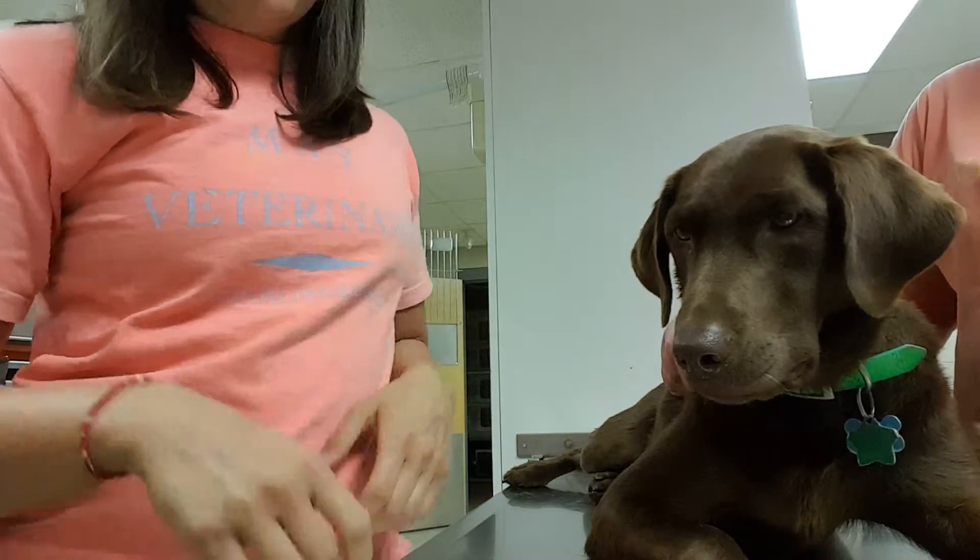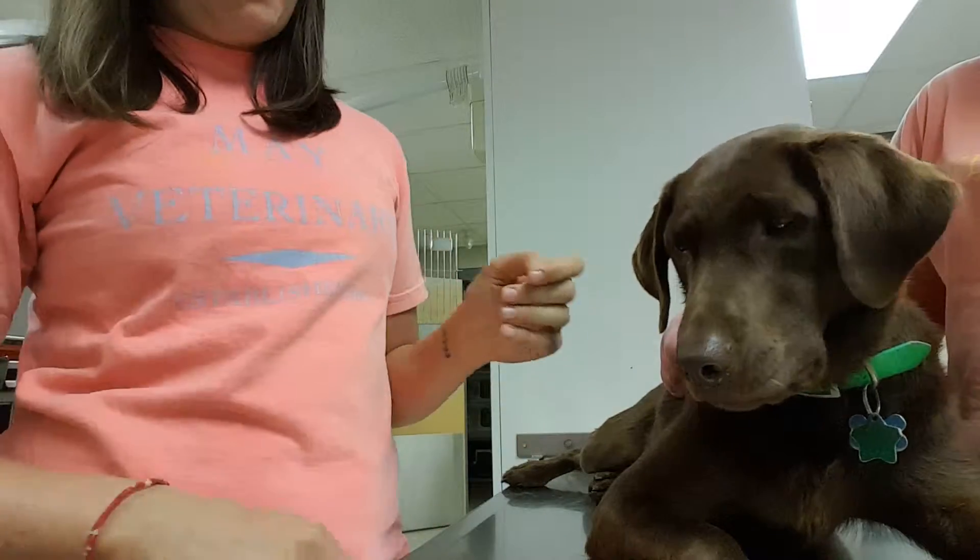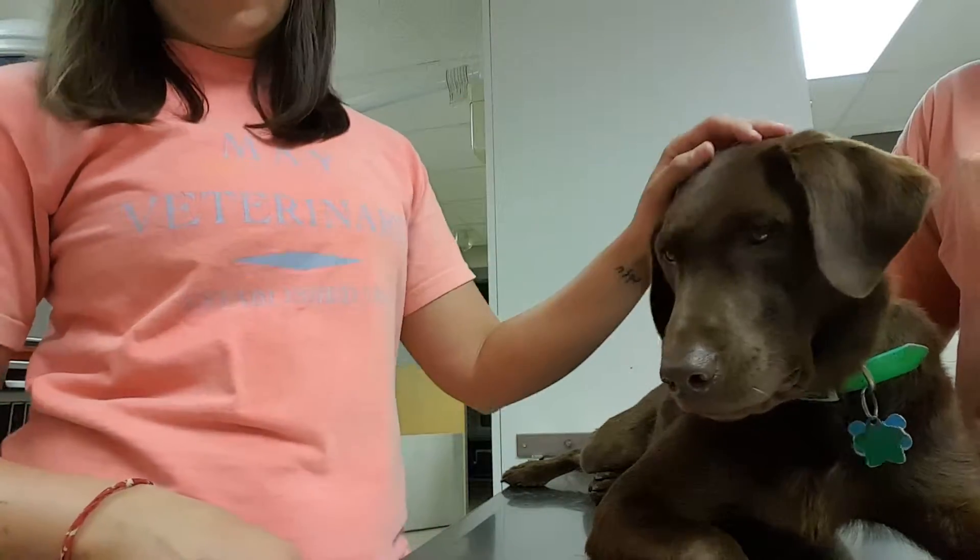Hi, my name is Brooke Armistead and I'm going to be performing the task of intravenous injection in a canine. Prior to this video, I've washed my hands and I've made sure that this is the correct medication and this is the correct patient.